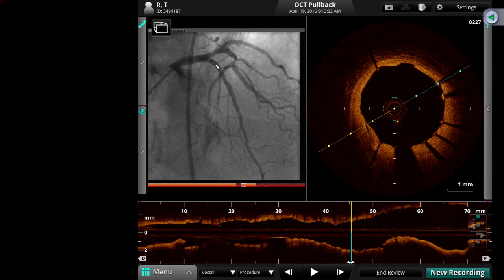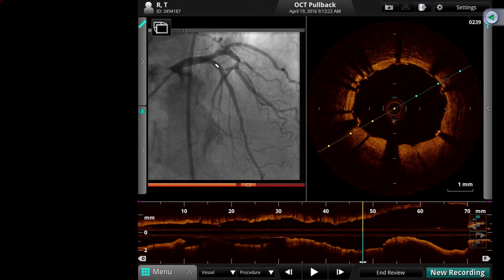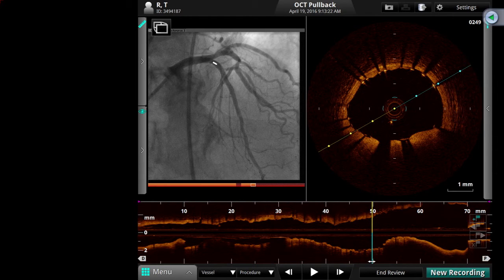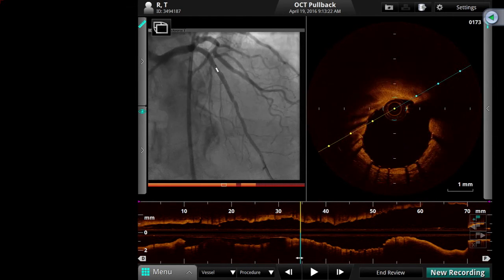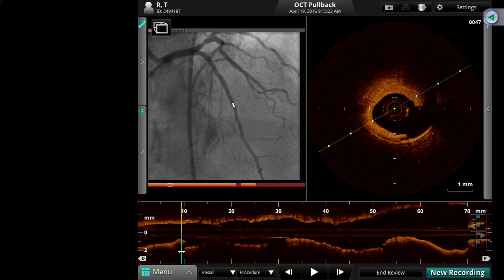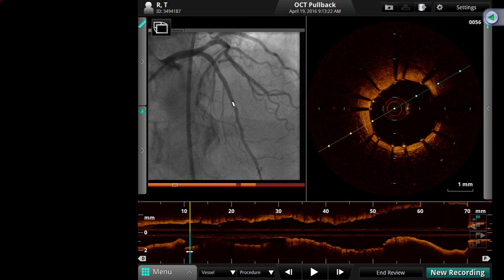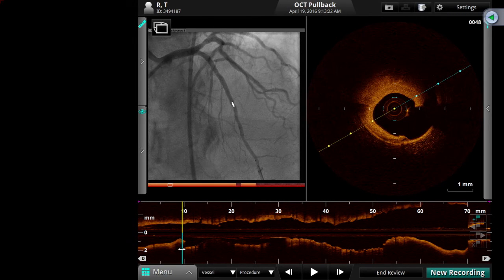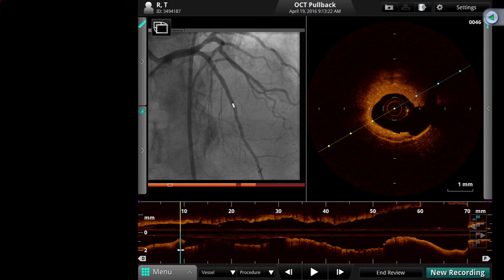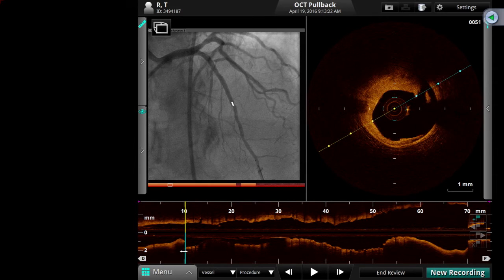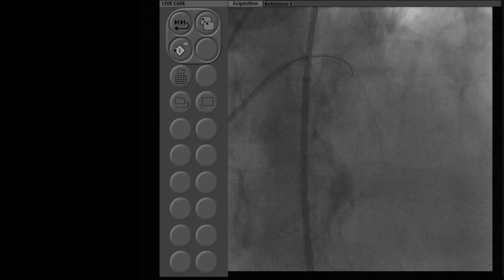We can take a 2.5 by 12 compliant balloon. Looking at the distal edge on OCT — there is little intimal disruption but nothing much. I think you could just do a balloon and leave it.